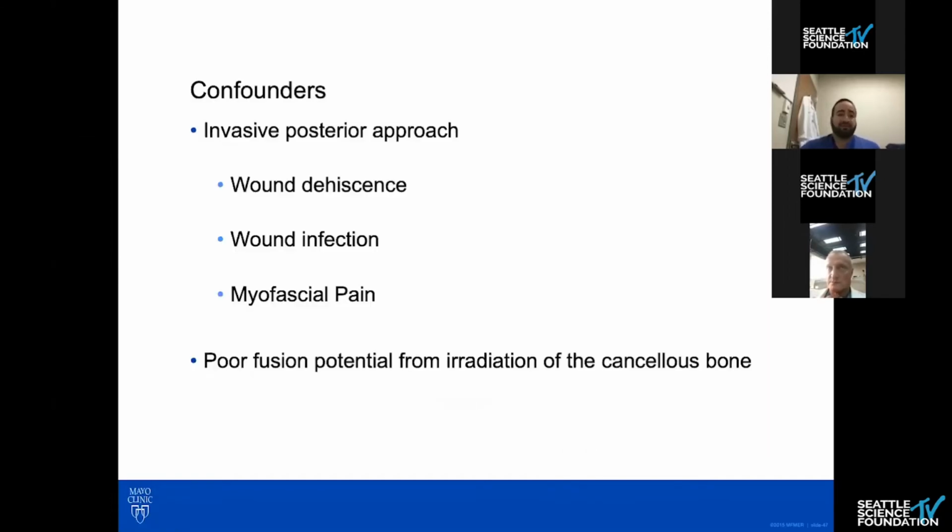So what are the confounders with these operations? Yeah, as folks live longer, as radiation gets better, we want to be able to deal with some of these issues that I brought up in terms of wound healing. Being able to operate on folks up front because the radiation therapists are more comfortable working around carbon fiber instrumentation is good, but I think an even next iterative step would be to try to do most of these operations on folks minimally invasively. We're not looking at arthrodesis, so there's no real incentive to perform very large open operations exposing a lot of bone surface that we would hope will eventually unite. That stuff is probably not going to happen.